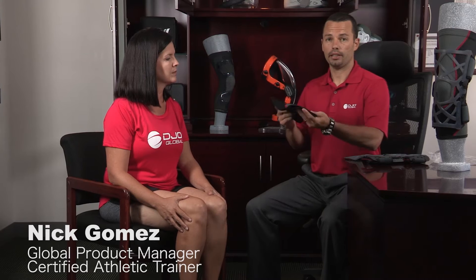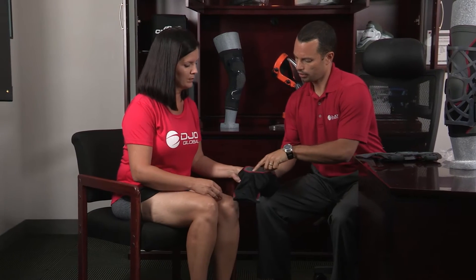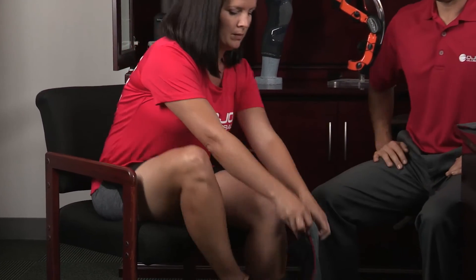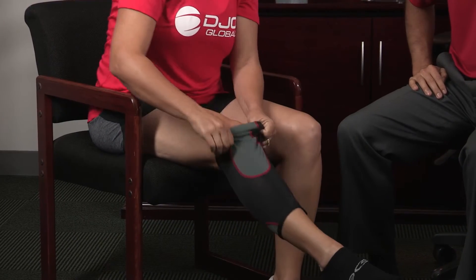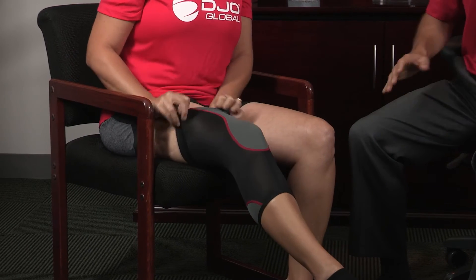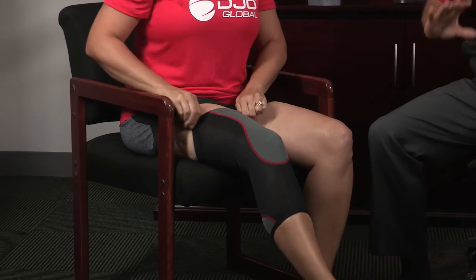We're going to demonstrate how to apply the knee sleeve and put the brace over the knee sleeve. This hourglass shape is going to go right around your kneecap area and you're just going to pull it straight up on your leg. The knee sleeve can be used for a little added compression and a little more comfort.